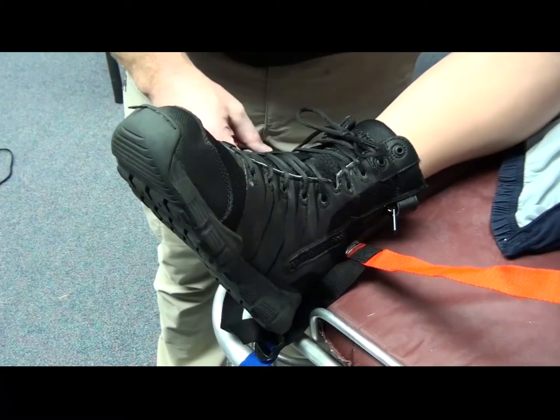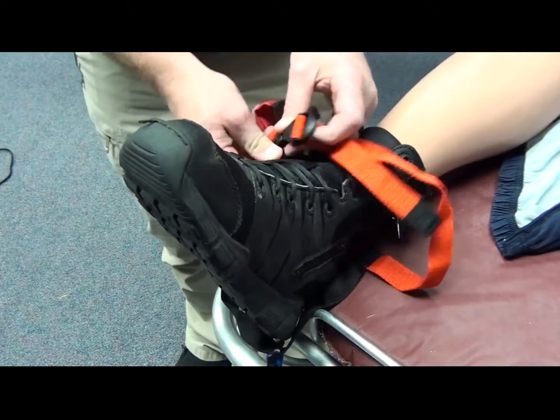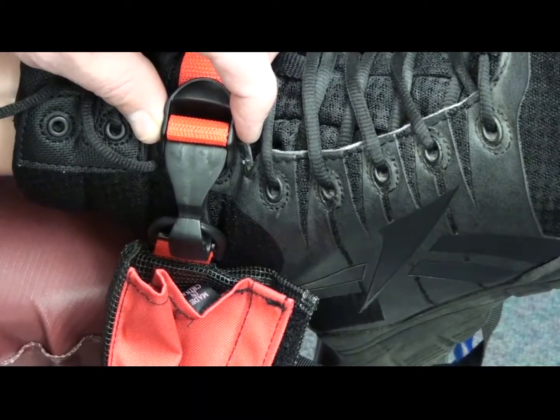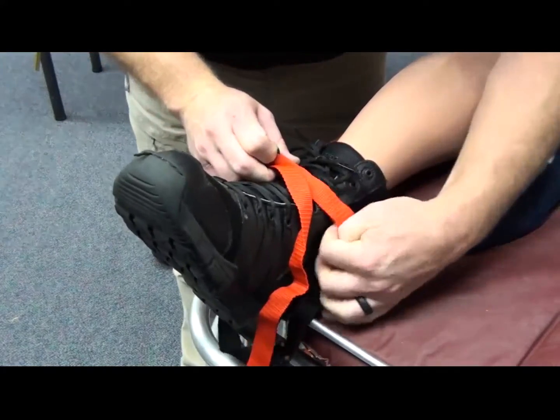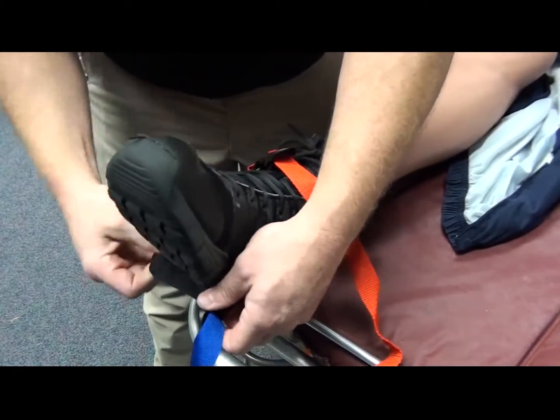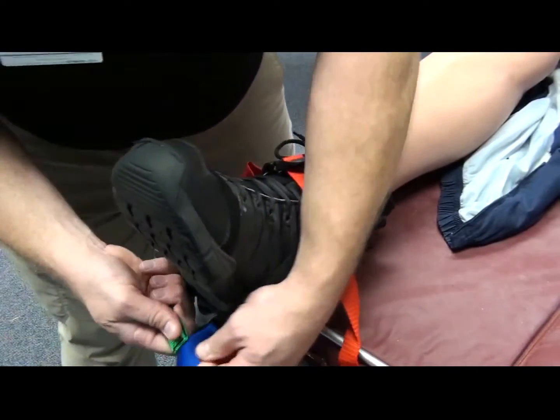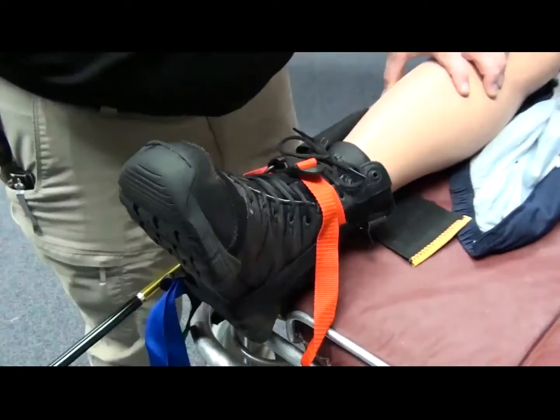So again, with traction, we're going to take our red strap and we are going to pull it over the leg and we're going to buckle it. When you buckle it, this is what it's supposed to look like. Just like that. Okay, now once you've got it strapped, simply pull the strap tight over the boot. Ensure that the bottom part of our hitch strap is down again below the bottom part of the ankle. Green tab, pull to where it's secure, and move our securing strap over to the lateral side.